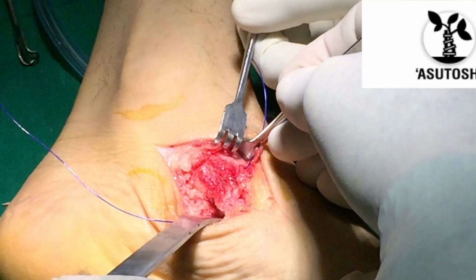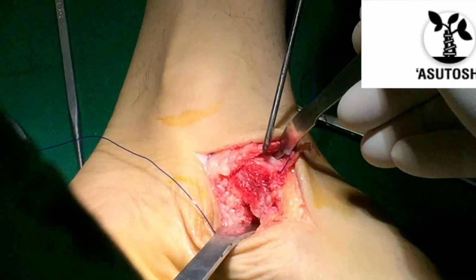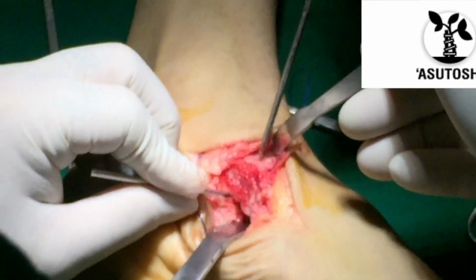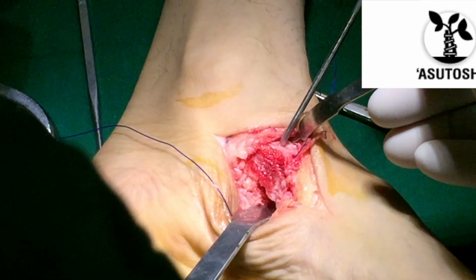And we are now isolating the superior surface. We are re-drilling the superior surface, so as to connect to the inferior portion of the tunnel.